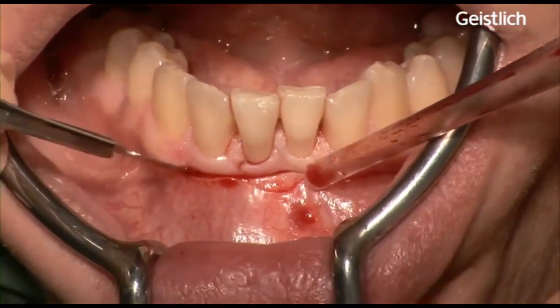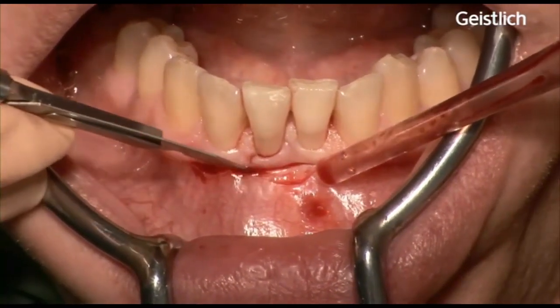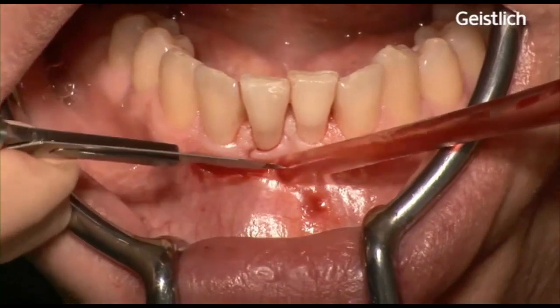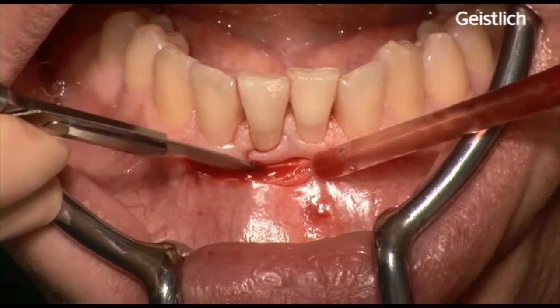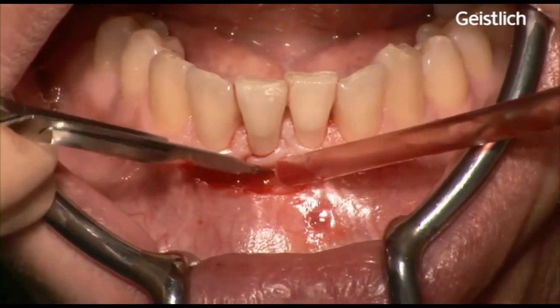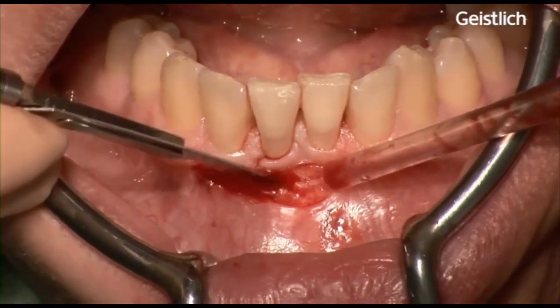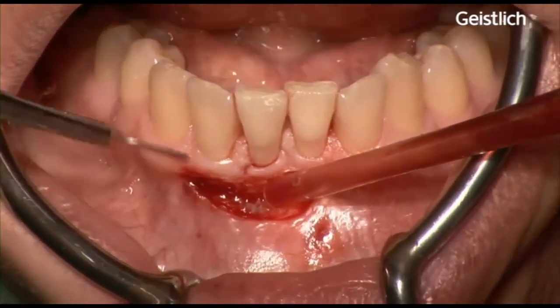A split thickness flap is prepared and care has to be taken not to cut through the periosteum. We proceed downwards until it is possible to move the flap passively in an apical position. To permit the apical advancement of the flap, eventually some muscle insertions have to be eliminated.